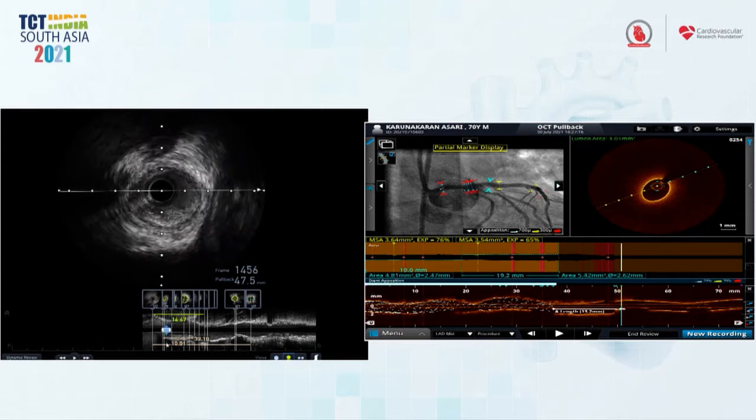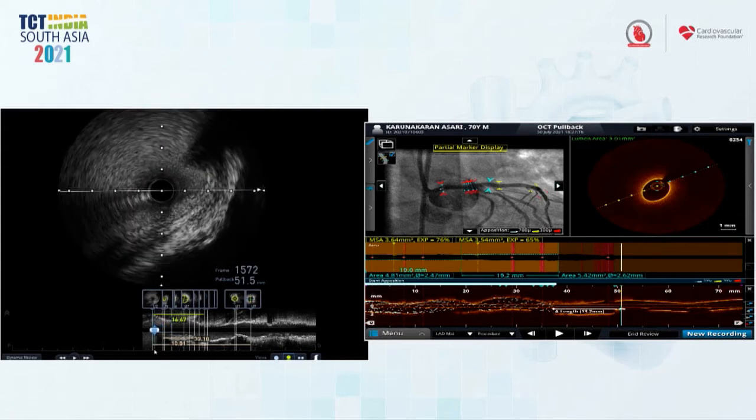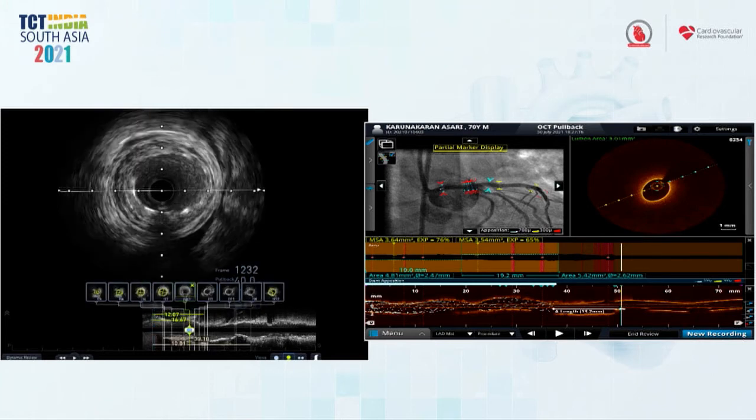We're showing you the IVUS now. That's it. Perfect. Put a bookmark here, just to show that distal. Yeah, that's correct. It is 12.7, 12.07. So it's about 12.5 at a stretch for the IVUS, and about 13 point something on the OCT. So we will have to put a 15 and overhang it outside a bit, if that's the way we need to go, and avoid the circ.